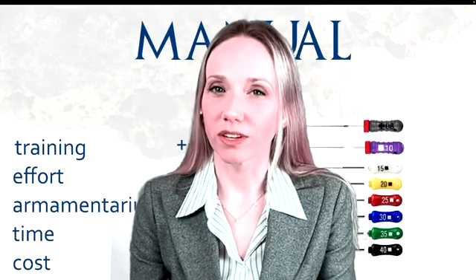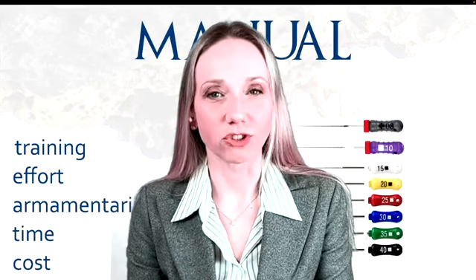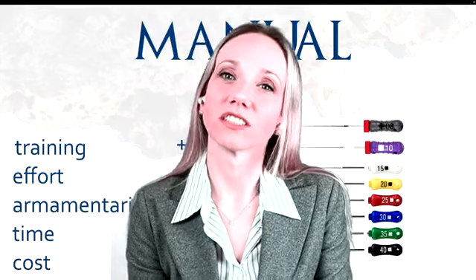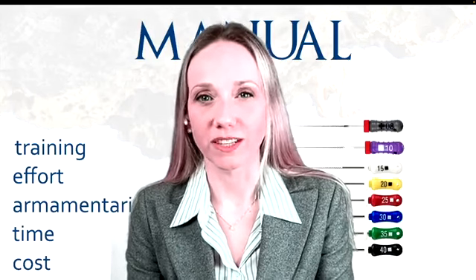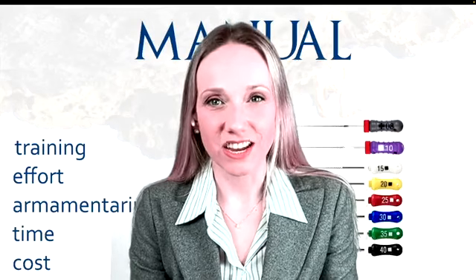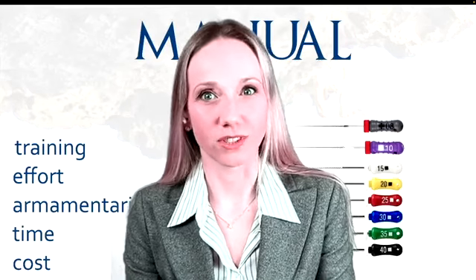It's cheap in terms of money, it's not cheap at all in terms of time, because if you ask the old endodontists that were used to doing endodontic treatment only with manual instruments how many appointments they needed in order to finish a therapy, you will be surprised. It was a lot of time and a lot of effort.